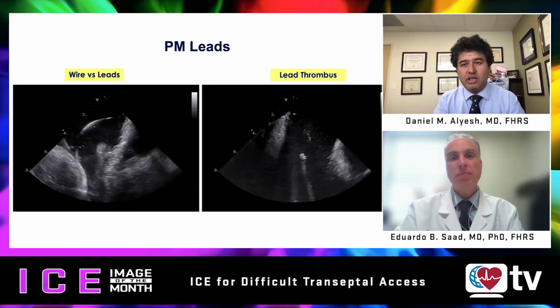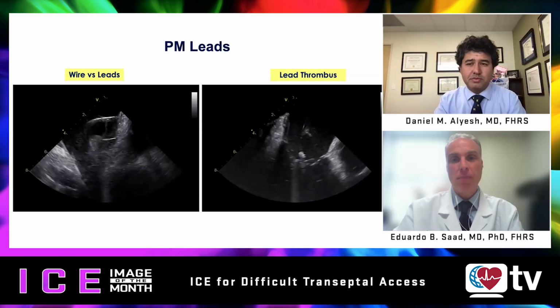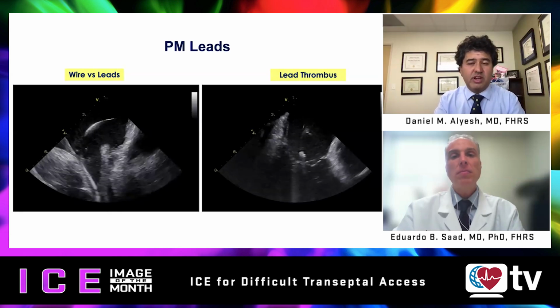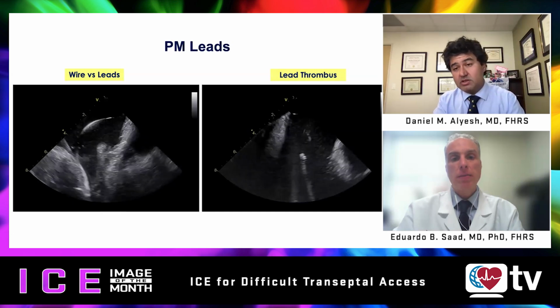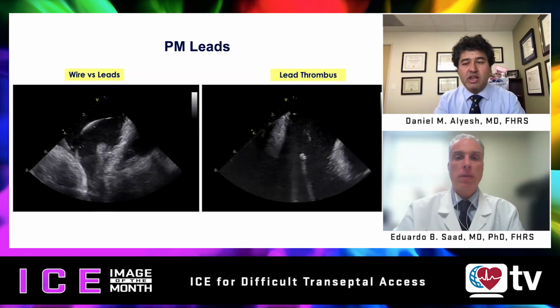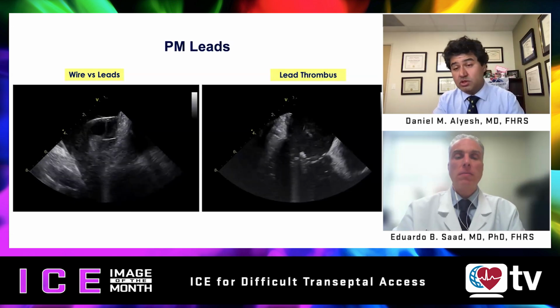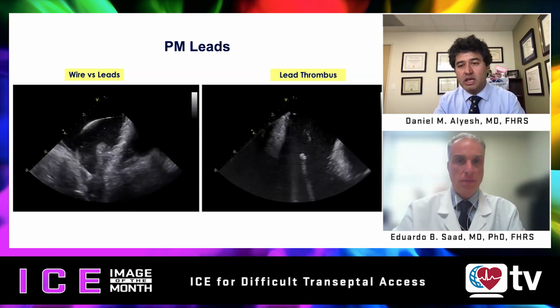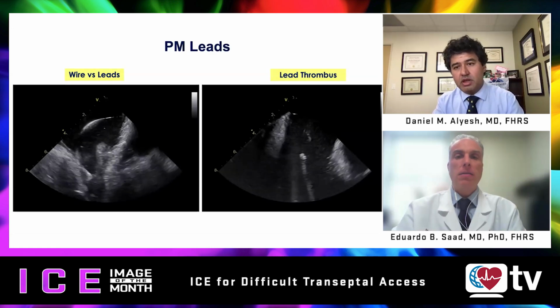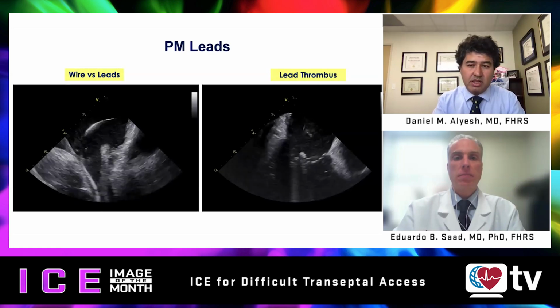I completely agree. For your first image, for advancing your sheath, this is very helpful. But it's also helpful for the drop: as you come down, you make sure you're not putting any stress on the leads. If you do see that you are, you can very quickly rotate your sheath to release the leads and continue your drop. So that's important imaging there.